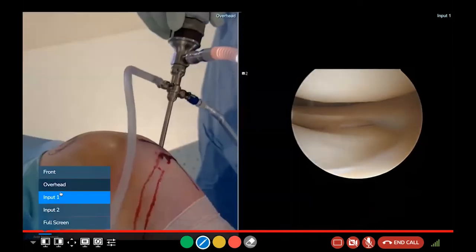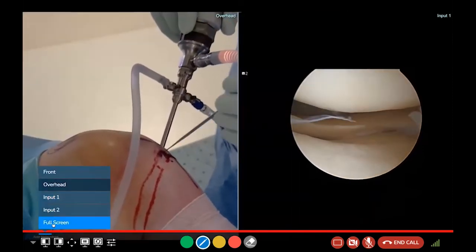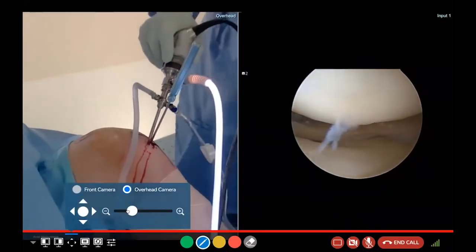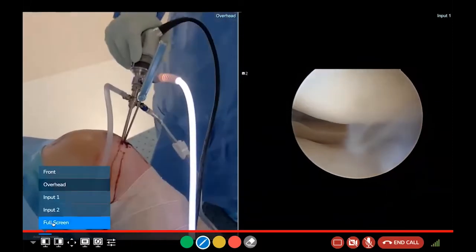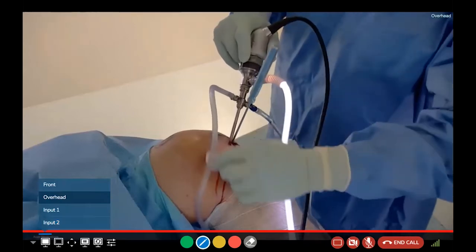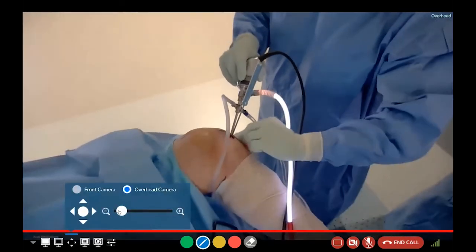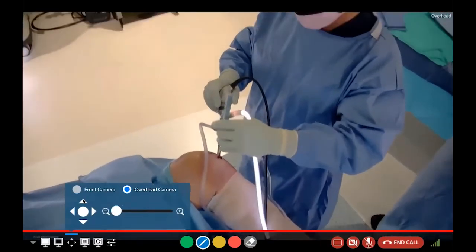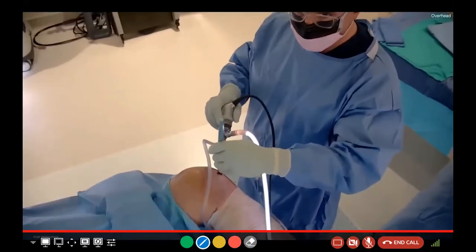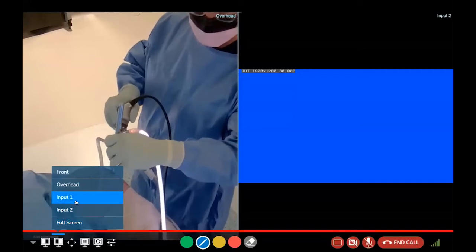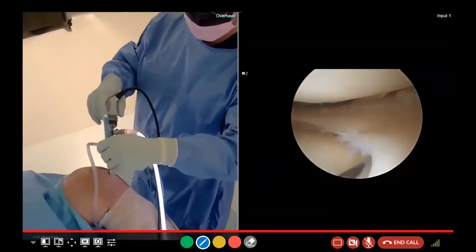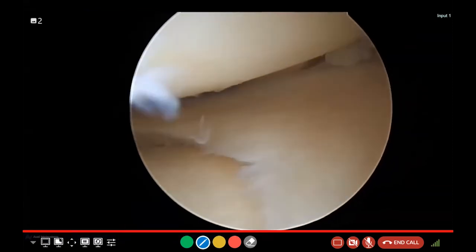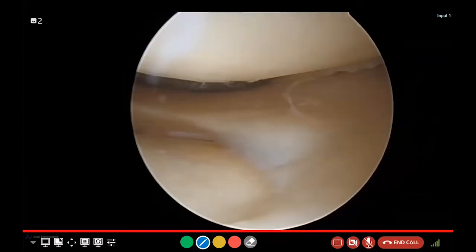This is the lateral side. I've kind of opened up the lateral side and I have this probe in the medial aspect. Now I'm in the figure four position on the lateral side. I told you I was going to show you what a normal lateral meniscus looks like — and this is the lateral side. It actually looks pretty good. You can see just a little free-edge fraying there but no tear. I pull on it — no problems. There are some loose bodies; I'm going to put a shaver in there and clean that out.